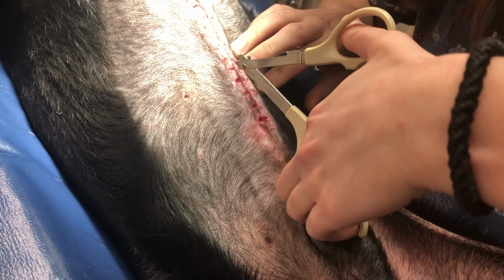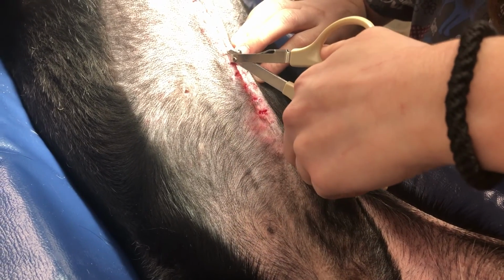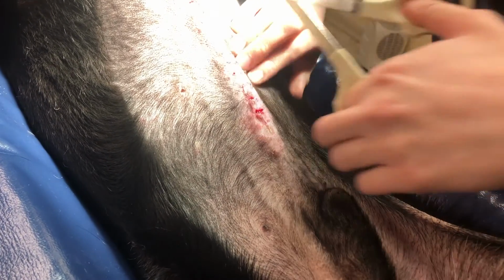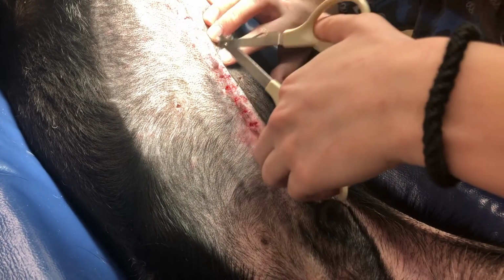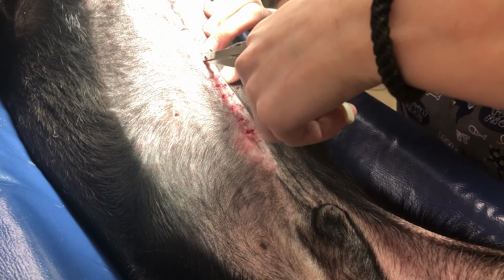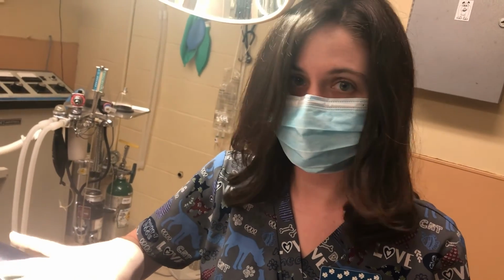And when you're looking at your suture area, you want to make sure that there's no inflammation, no redness, and there are no gaps on the line there. So this looks pretty good. Looks like most of them are taken out, so there's just one more. And we'll give this area a good scrub so we can get rid of all the crusty stuff on there.